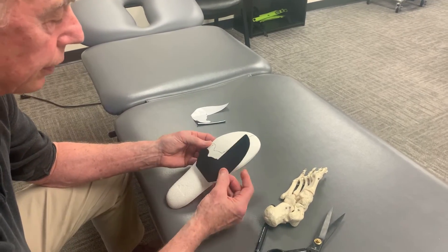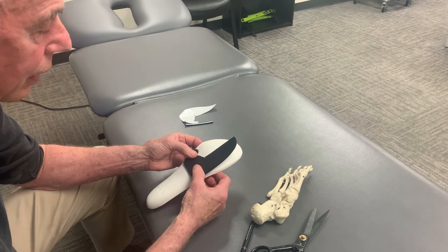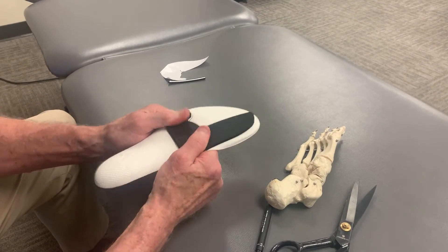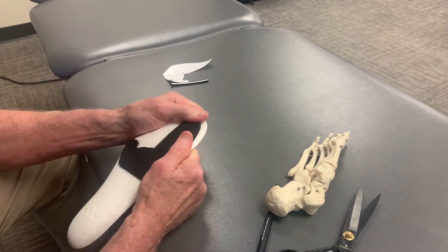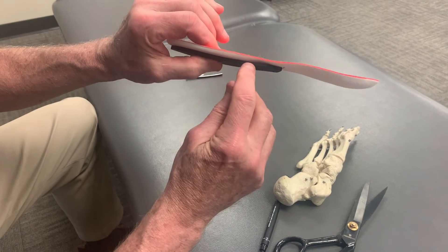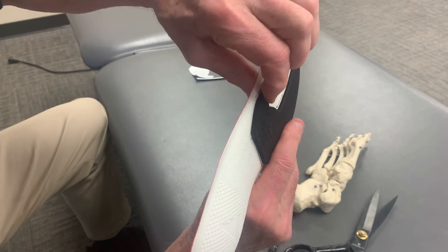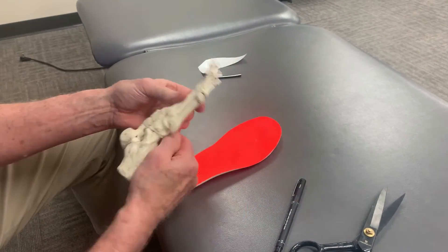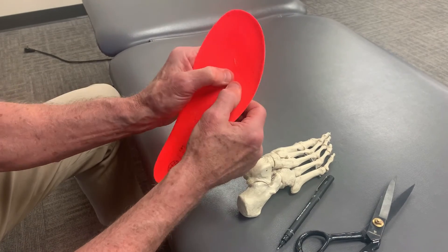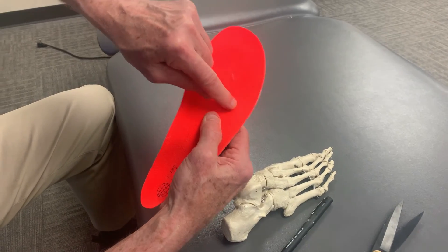Once you've got the spot marked, you apply it just like that — nice and light. If you put it on lightly you can move it if needed, then double-check it. Once it's in the right spot, push down and flip it over. There's a thick spot supporting the first metatarsal, the hallux, and the second, then a little lip providing elevation supporting the fifth. You're basically creating a little pocket for those metatarsals to sit in, so when they go into their propulsive period — you can even see that little crest forming — there's going to be no pressure on that spot.